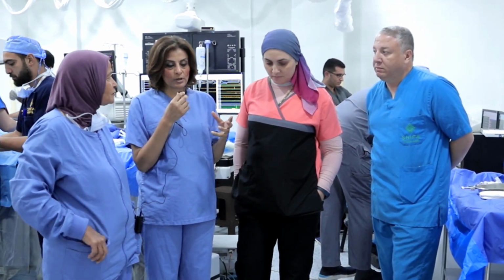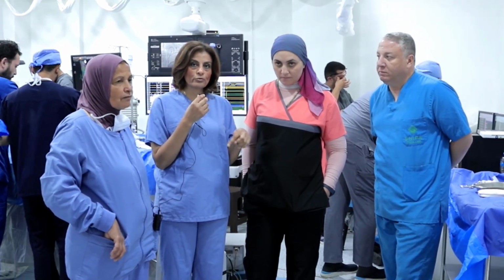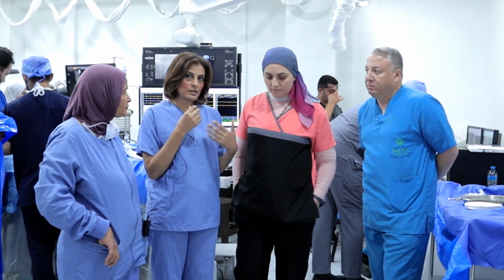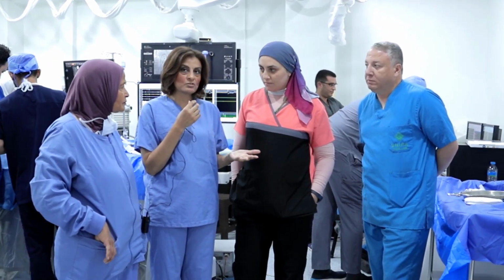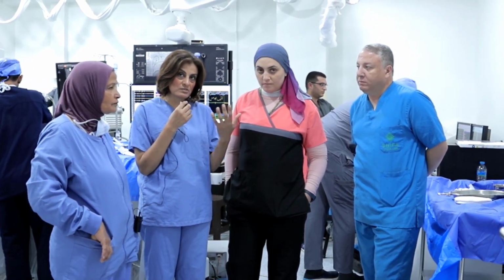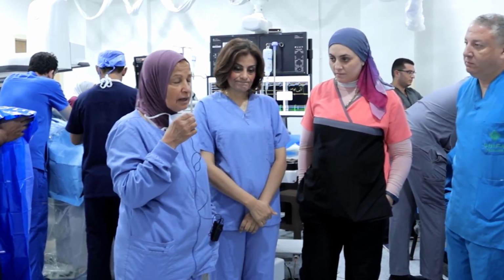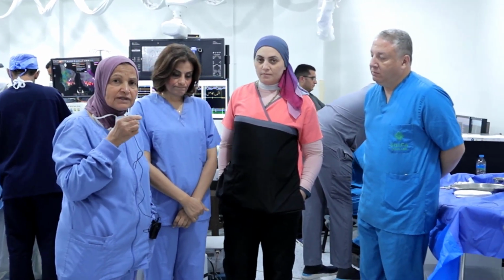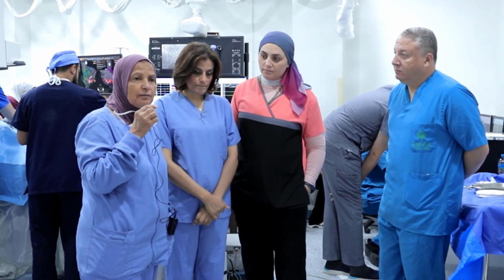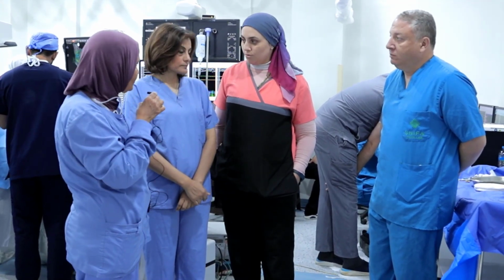And we tried to localize whether it is re-entrant or focal, and we decided after entrainment and after activation map that it's a re-entrant tachycardia, and it's related to the CTI, to the previous CTI ablation. He underwent conventional CTI ablation in 2008. After that, he underwent focal atrial tachycardia ablation in France, from the right atrium. We don't have any report.